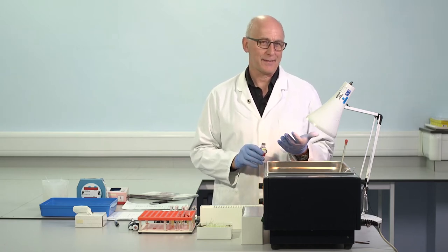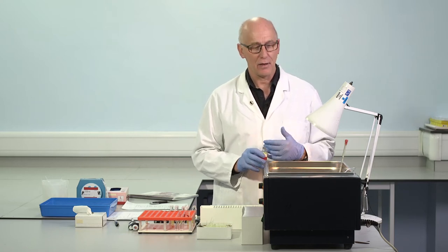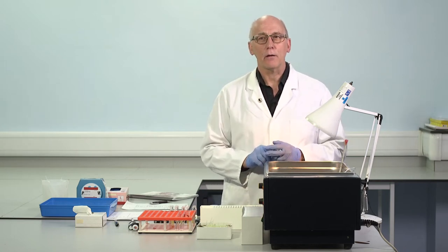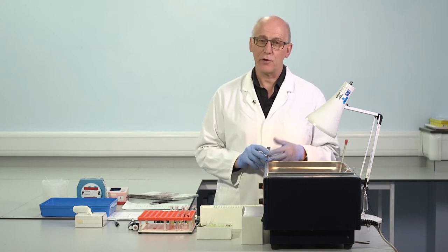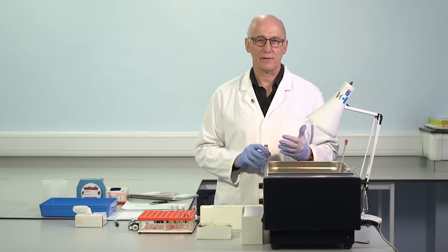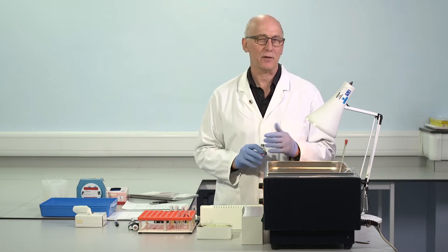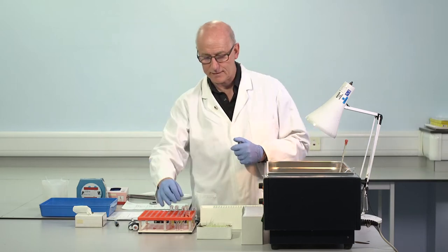And for an automated system, we should pay careful attention to the recommendations of the manufacturer. Just now we're working in a water bath. It's important to choose an appropriate secondary container. For many plasmas and some reagents, we noticed that the reagents are less affected if they're moved into secondary containers made of plastic, and sometimes there can be problems with some types of glass. So I'm going to use plastic tubes on this occasion.